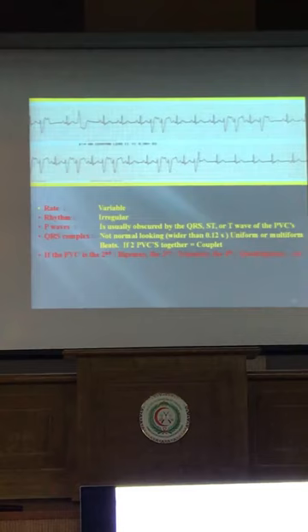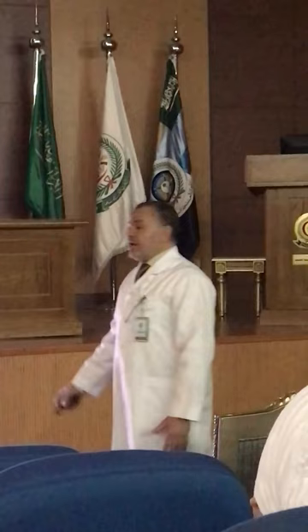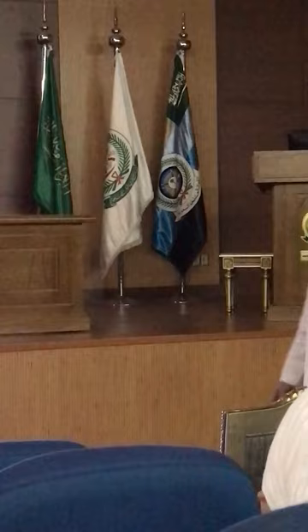As I told you, premature beats can come from anywhere — atria, junction, or ventricle. How to know? According to the abnormal wave. If the abnormal wave is the P, P represents atrial contraction, so this is premature atrial. If the different morphology is in the QRS, this is ventricular. For premature junctional, the P will be absent, behind, or negative before/after. Let us concentrate on premature ventricular contraction.